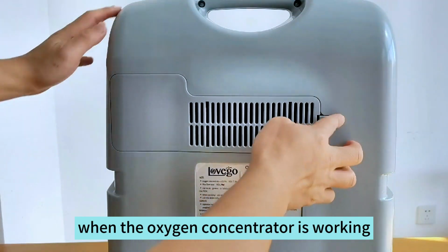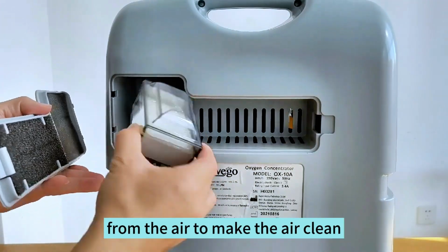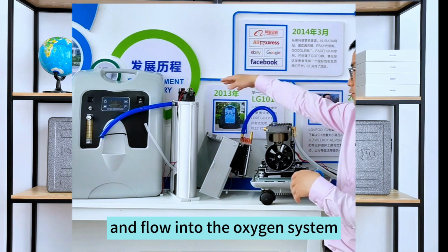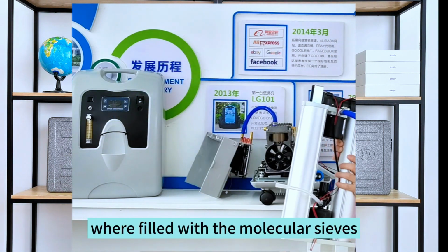When the oxygen concentrator is working, firstly it filters the dust and other impurities from the air to make the air clean, and then presses the air by compressor and flows into the oxygen system. We also call it the sieve barrels, which are filled with the molecular sieves.